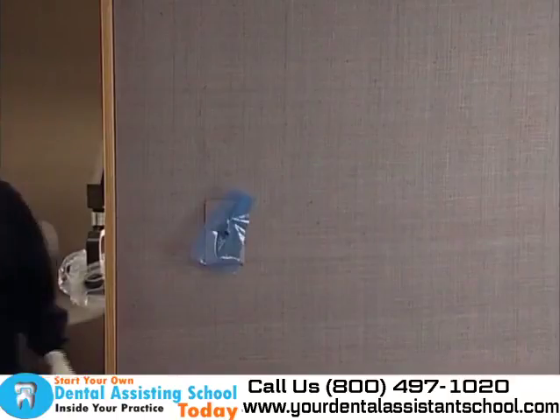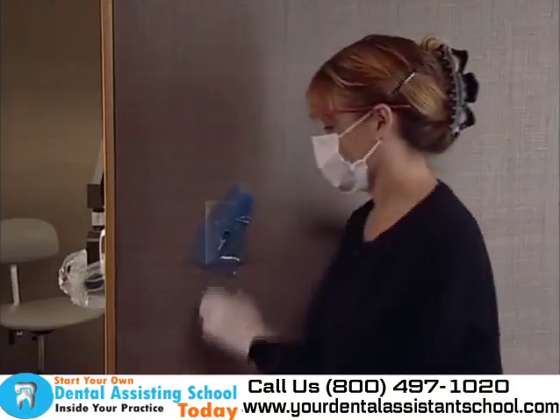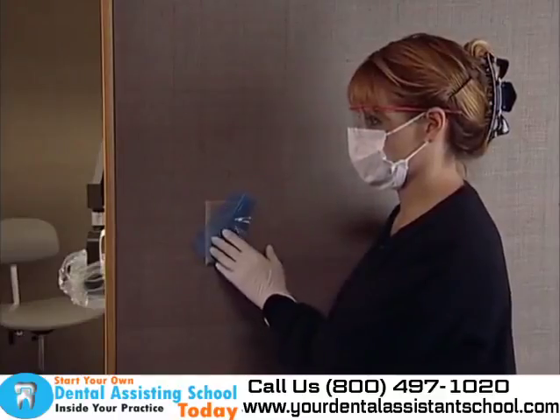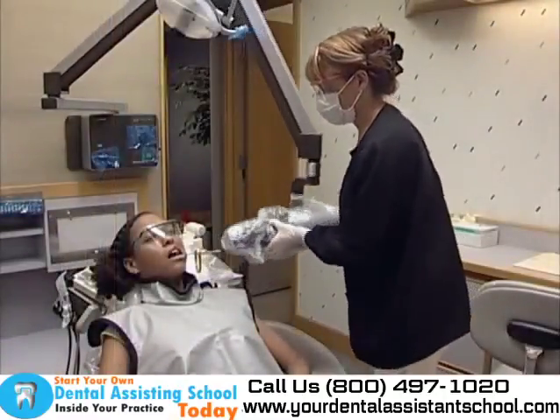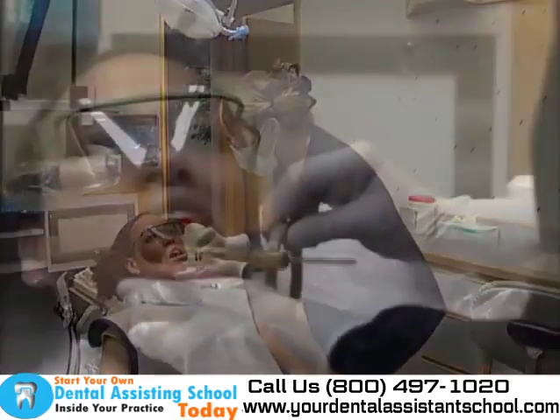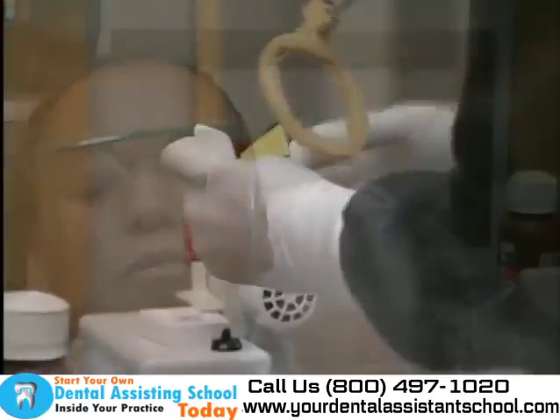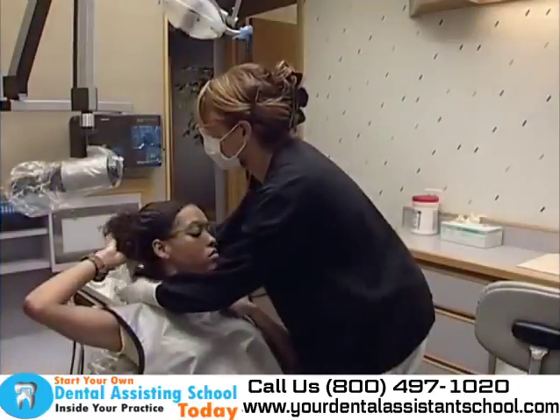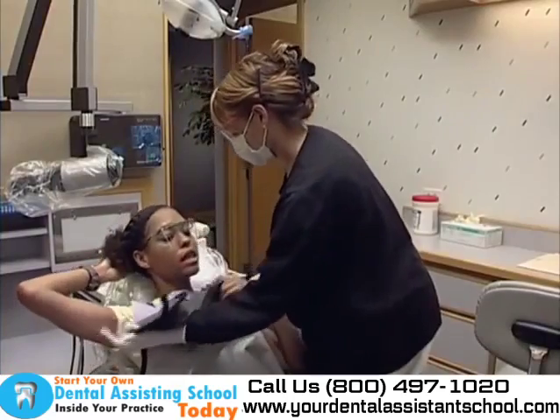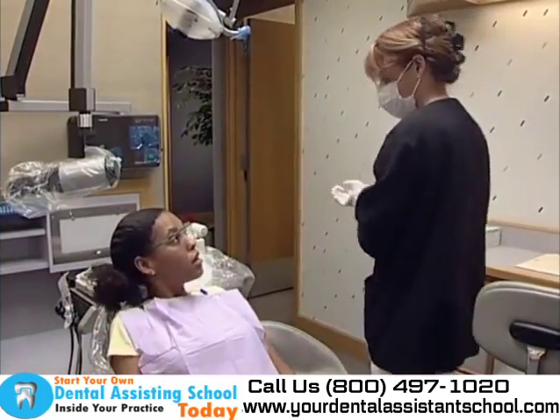When the dental assistant is a minimum of 6 feet away from the X-ray machine, he or she activates the exposure button and takes the X-ray. Upon re-entering the room, the film is removed from the patient's mouth. If another X-ray is to be taken, the assistant repeats the process. When all X-rays have been taken, the assistant takes off the patient's lead apron and thyroid collar.